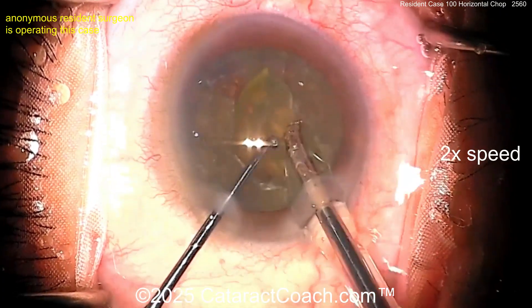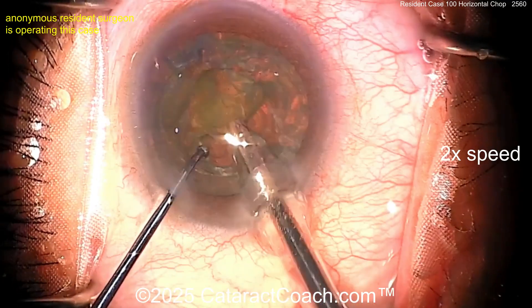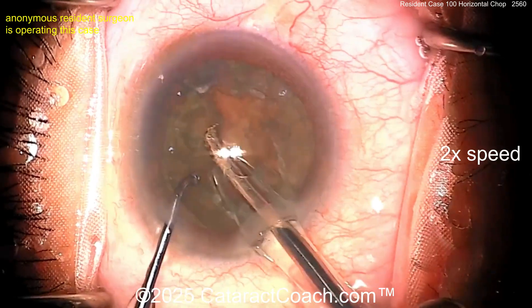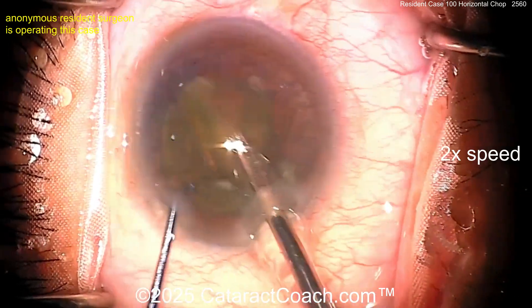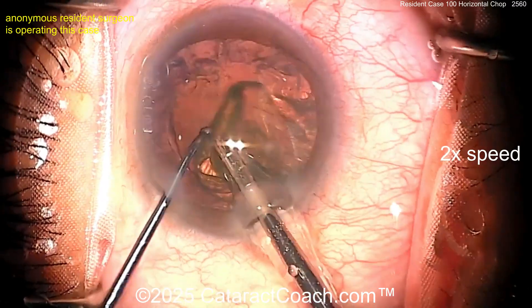Look at that — bringing that piece up. Once you get a hold of it you can aspirate it, or give another sub-chop if you need to. I like how the eye stays in primary position this whole time — that looks just great. Good draping, the lid margin sequestered. This is not a very dense cataract, which is okay, but that was just a beautiful chop technique.